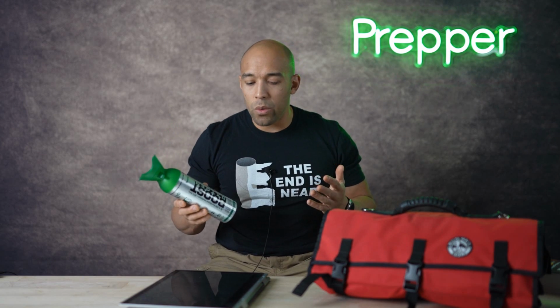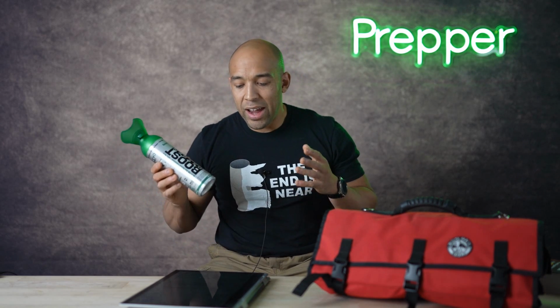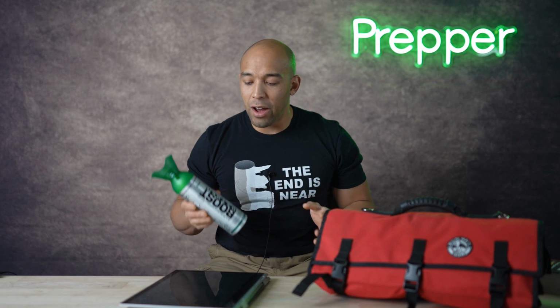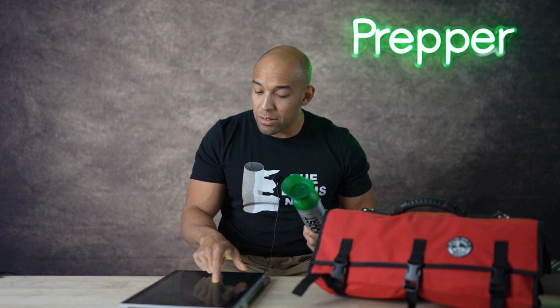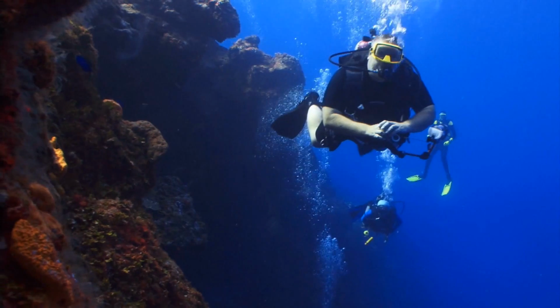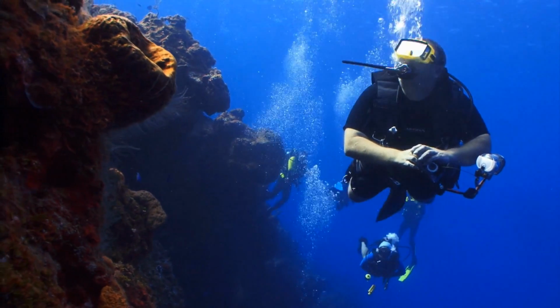Now, apparently there's no negative side effects. There is a condition called oxygen toxicity, and in order for you to succumb to that, you would have to hyperventilate pure medical grade oxygen for 16 straight hours in double the normal atmospheric pressure. Okay, that could potentially cause irreversible lung damage, convulsions, and perhaps death. But this, of course, is extremely unlikely, and the only people who might experience such a rare situation are divers who might be trapped underwater for many hours. So there's nowhere near enough oxygen in a canister like this for that to ever happen.